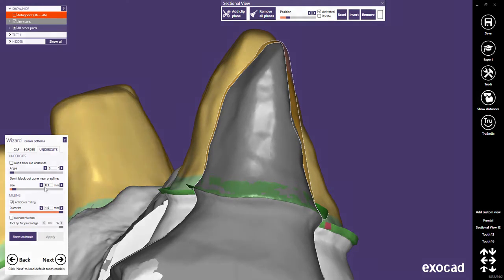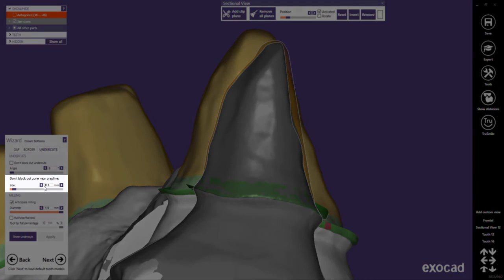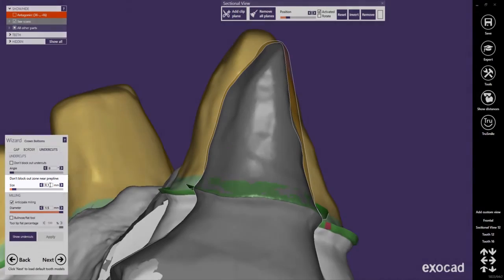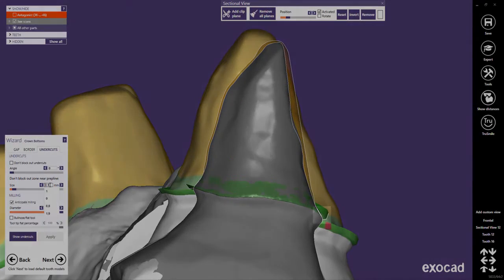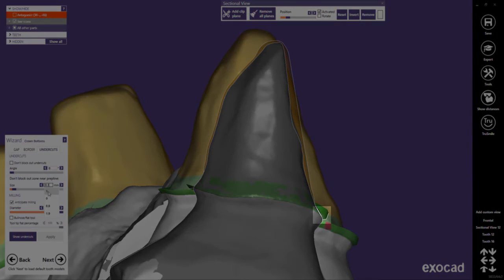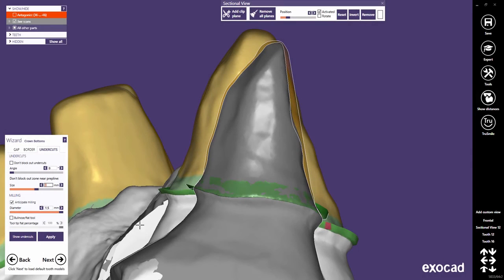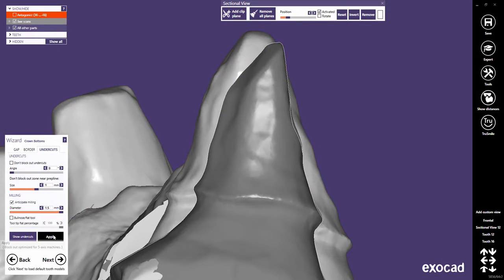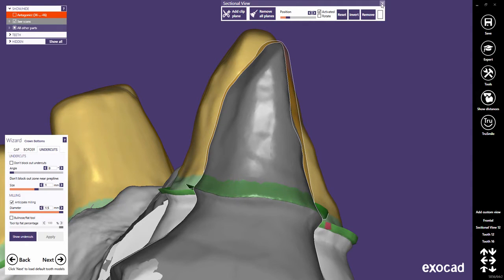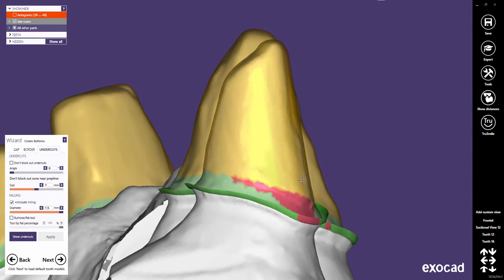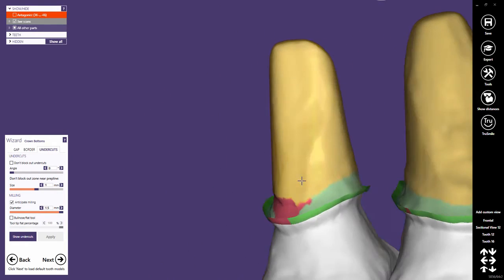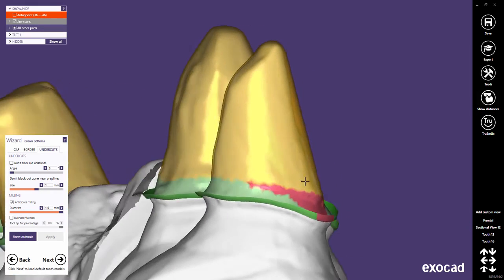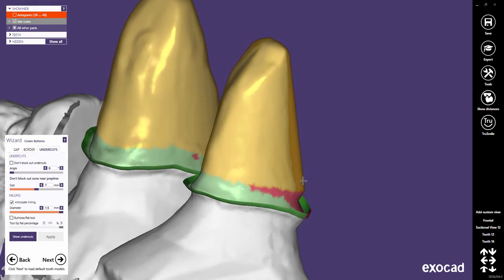The slider, Don't block out zone near prepline, defines an untouchable zone around the preparation margin, where the crown is never blocked out. You see now how the upper part is blocked out, but as soon as the untouchable zone is reached, the crown bottom will go back to the preparation.